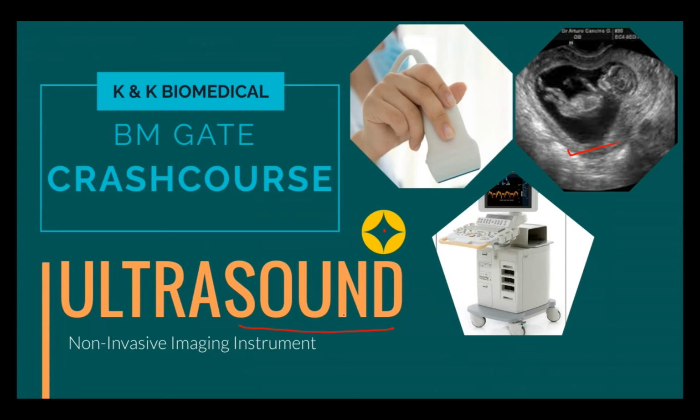Why? Because of the applications of ultrasound. One application is imaging a fetus in a mother's womb, for those who are pregnant, and in some cases identification of kidney problems, especially in women patients.